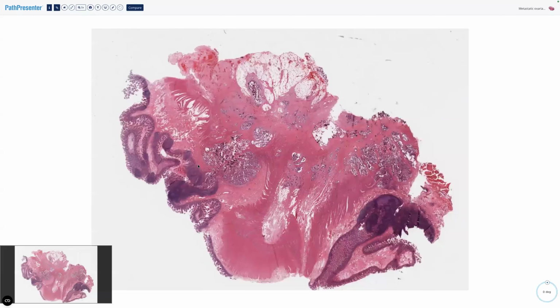So this is the most common tumor that I see, the high-grade serous carcinoma. And we know that this is bad because this is clearly small bowel here. All right. High-grade serous carcinomas most often present at stage 3. In other words, they have spread around the abdomen. And most often, I get two kinds of specimens. I get the specimen that's the diagnostic biopsy before they start chemotherapy. And then I get a specimen after 3 cycles of chemotherapy, which is the interval debulking specimen. This is an interval debulking specimen.